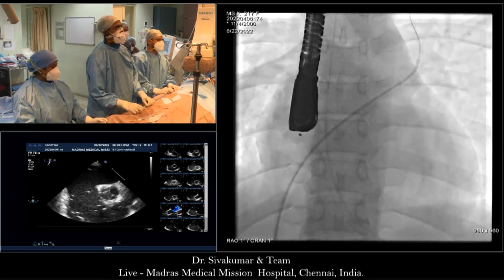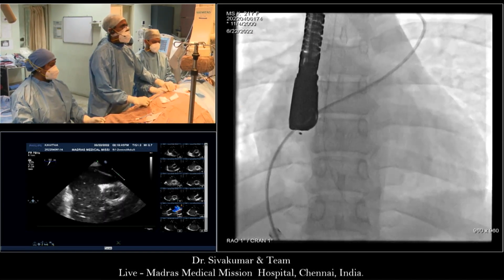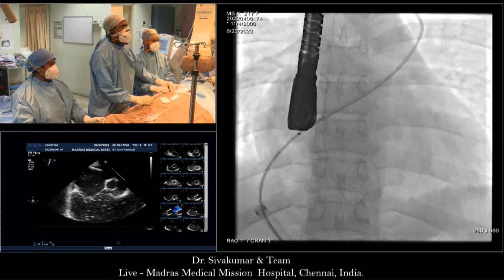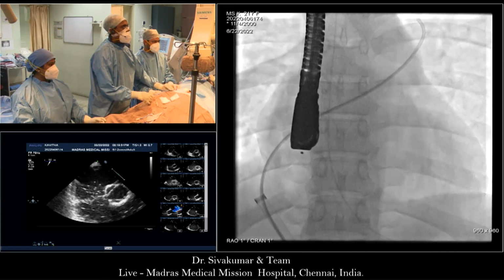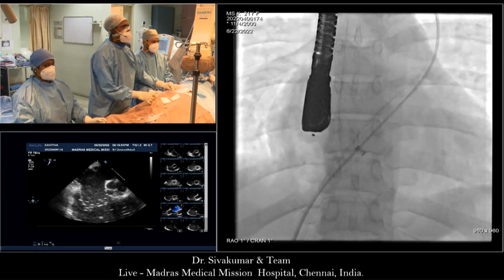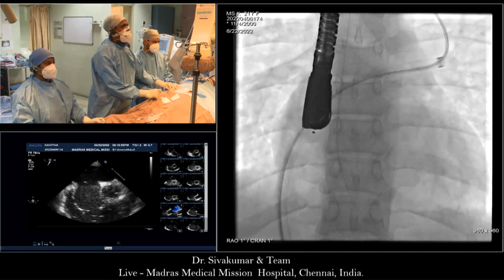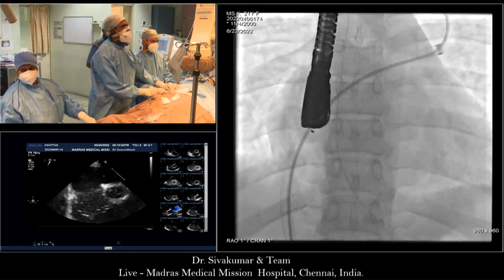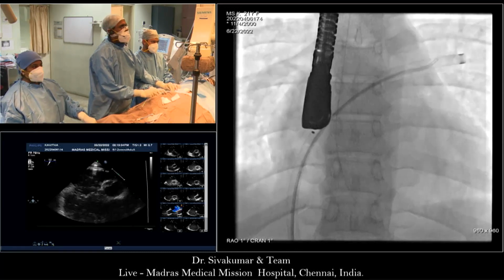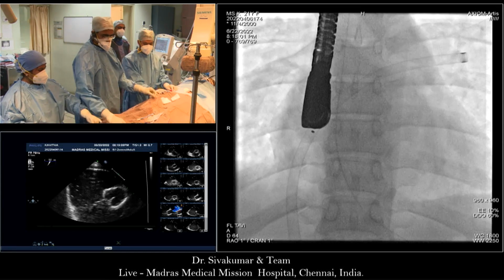Okay. So, Bharat, quick question. In your talk you mentioned multiple deficient rims, large ASDs are at risk. Here the anterior superior rim is almost absent, and the posterior rim also is. But I think, Srinath, the device will hold. If there is no significant malalignment, which I'm not able to say with 100% certainty, the device will hold. I think these rims are good enough for the device to hold.